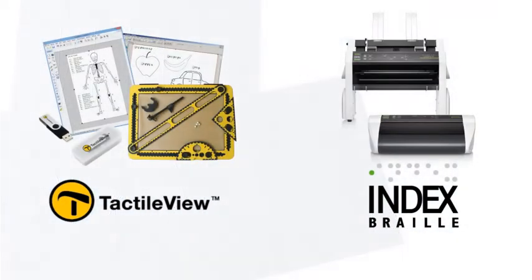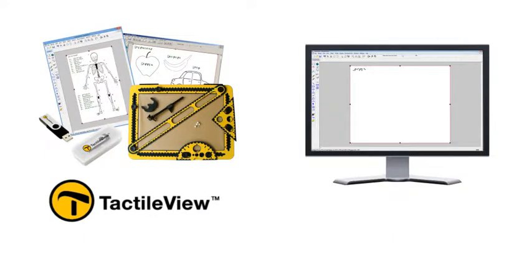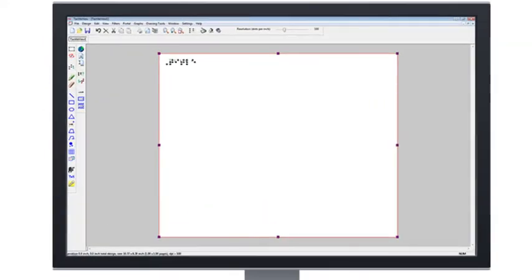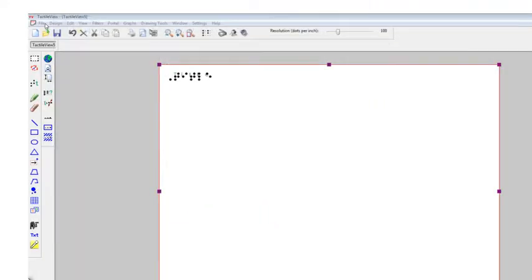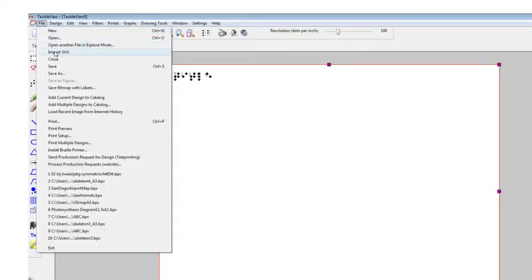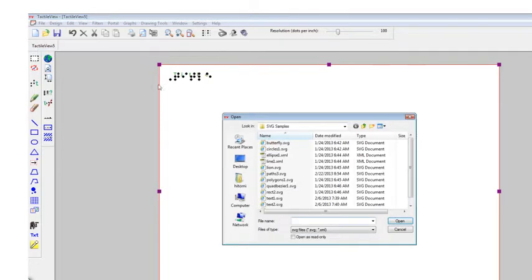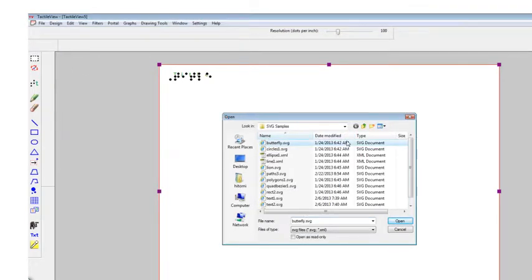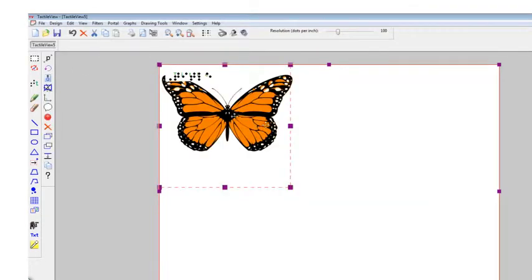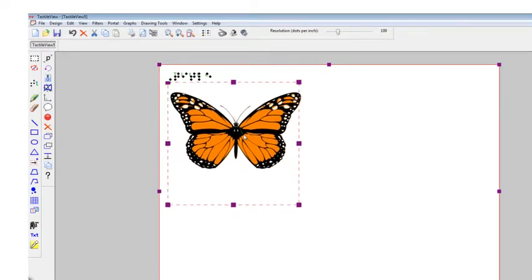The TactileView Design Suite and TactiPad by Thinkable offer the complete solution for tactile graphics creation. Within seconds, you can import SVG and bitmap image files or download pre-existing diagrams from an online catalog.